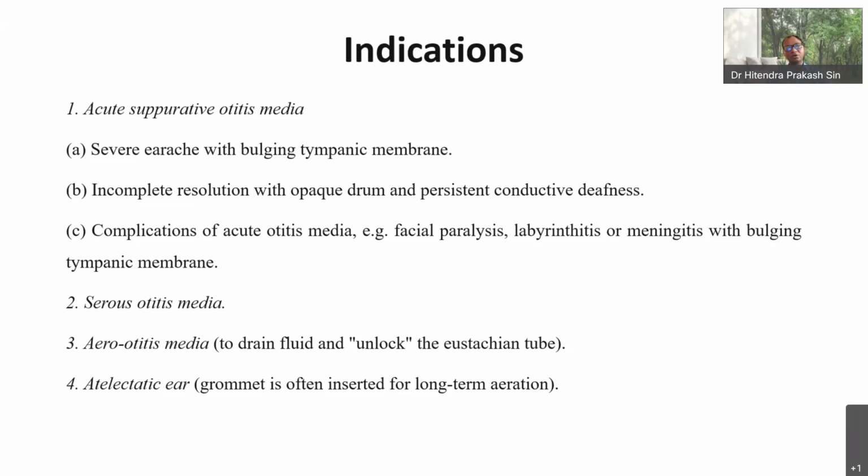So, in those cases, we again perform the myringotomy. And when there are complications of acute otitis media, such as facial paralysis, labyrinthitis, or meningitis, and the tympanic membrane is also bulging, then we need to perform a myringotomy so that the pus can be drained out and these complications are easily managed.